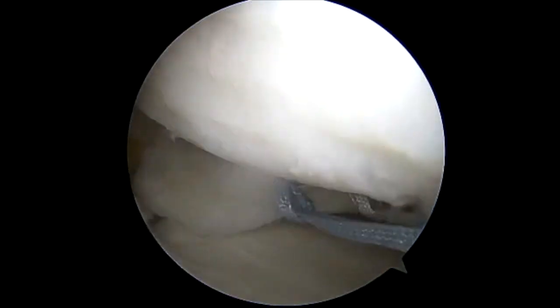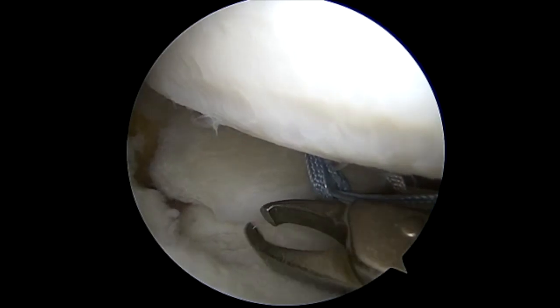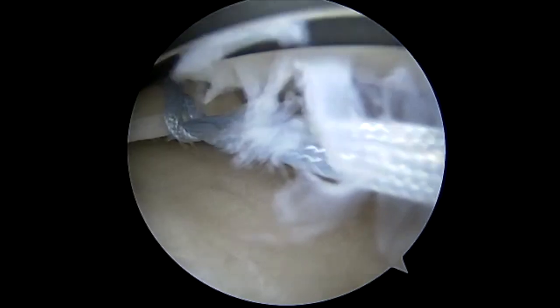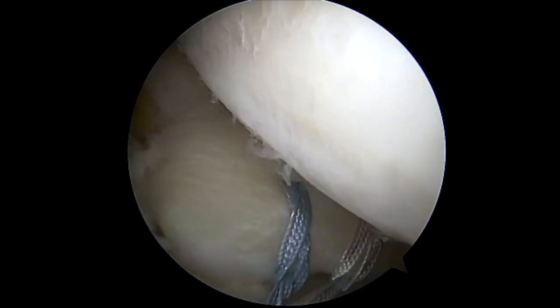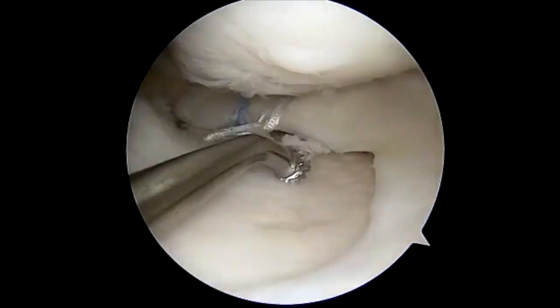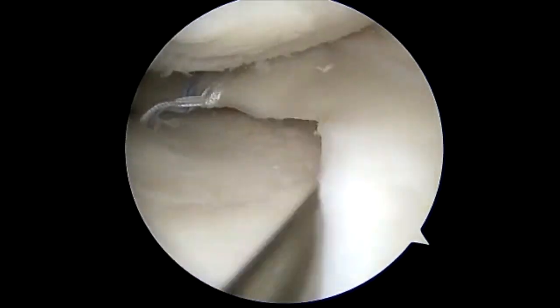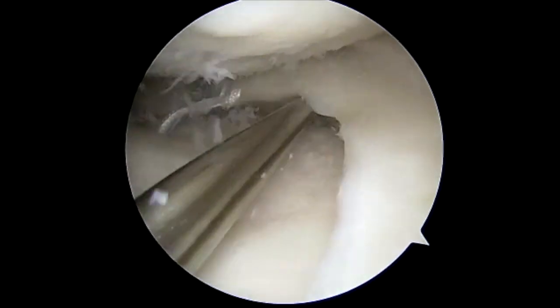Given this is a chronic meniscal root tear, we're going to add the extrusion stitch, as there's been some good research to demonstrate this may improve overall outcomes. Recent studies by LaPrade have demonstrated more biomechanical construct with adding a secondary extrusion stitch. We can pull these through the tunnel of our meniscal root repair and pull the meniscus almost all the way back to its anatomic origin. But given this is chronic and the patient had over four and a half millimeters of extrusion, the decision was made to perform this new extrusion repair stitch.